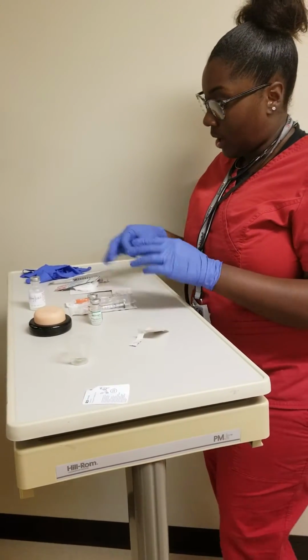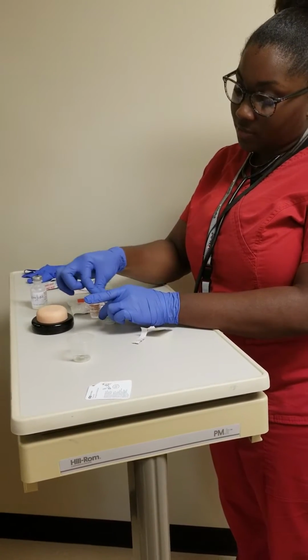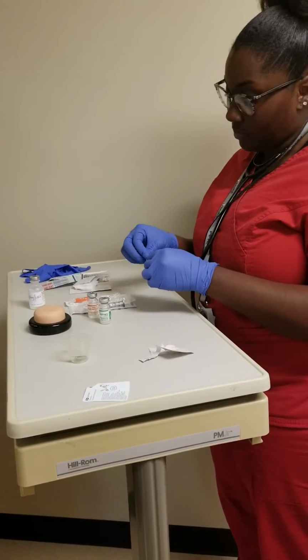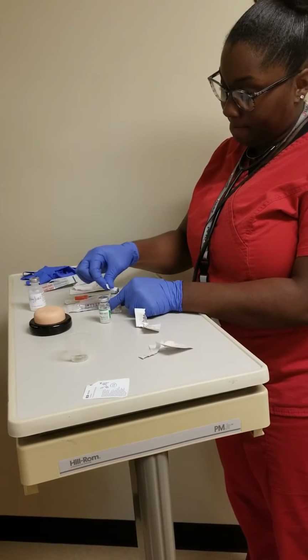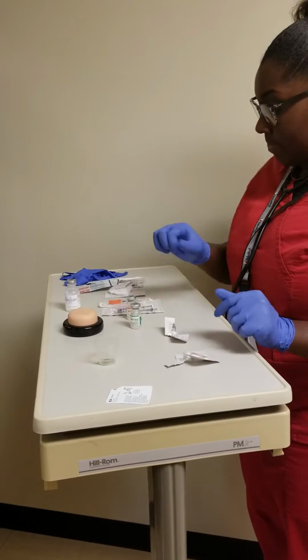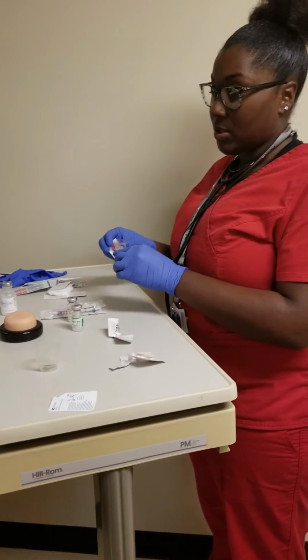I would gather all my supplies, which I have. I would clean off the vials. I will get my insulin needle, and I also will check the MAR again.